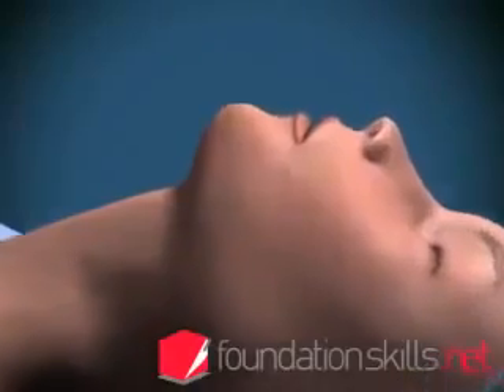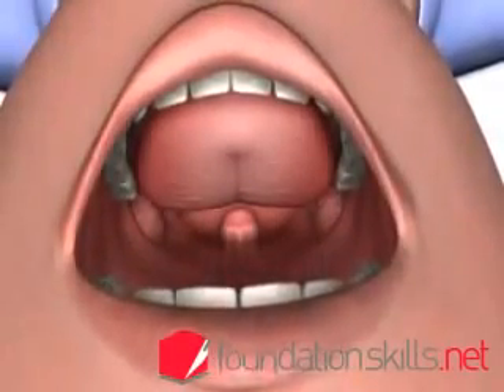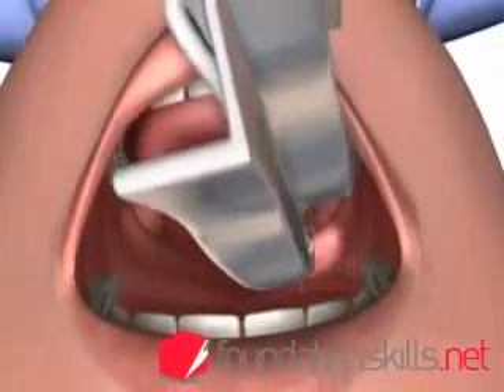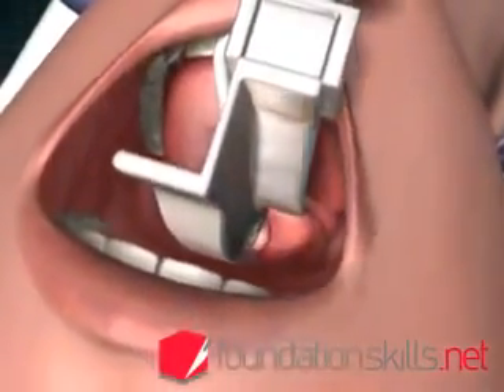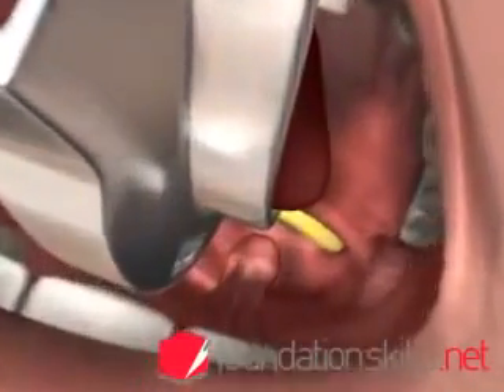Standing behind the patient with the head in the sniffing the morning air position, with the left hand, insert the curved blade of the laryngoscope into the mouth over the right side of the tongue, displacing it to the left and upwards. Advance the laryngoscope slightly until the tip of the epiglottis can be seen posterior to the back of the tongue.